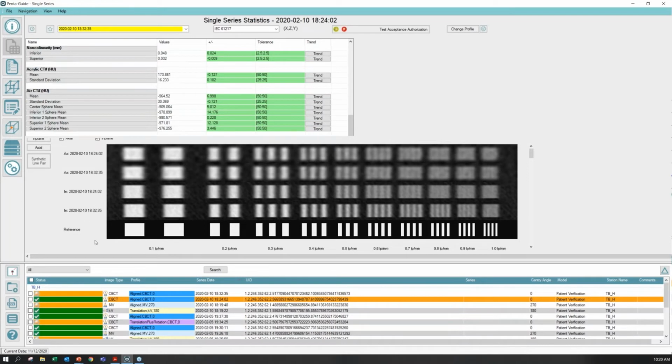Okay, so this is again just to provide some familiarity, because sometimes if you're just throwing a number of an MTF, it may not mean anything to you. So you can actually look and see how your MTF is performing.